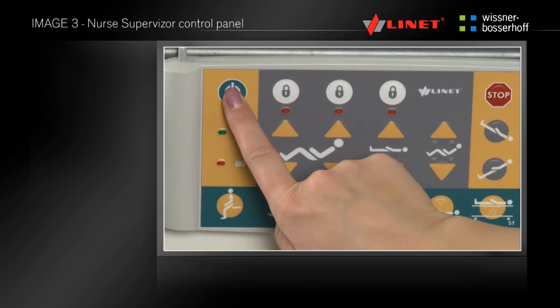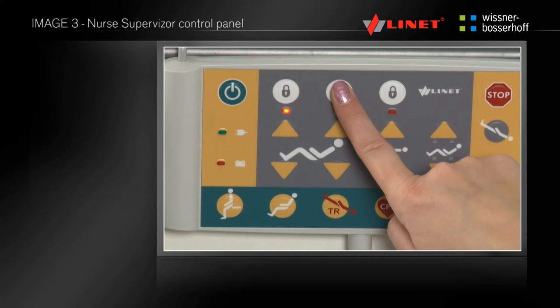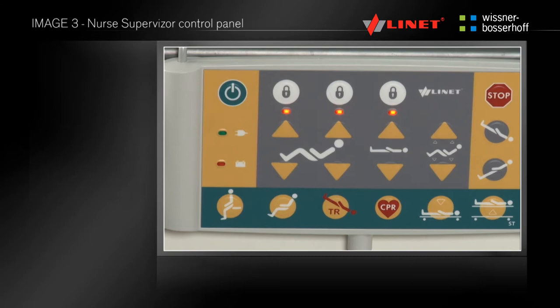You can lock some positioning functions by pressing the corresponding button on the main panel. With locking, you deactivate the relevant function even at other drivers. Functions are activated again by repeated pressing of the buttons.